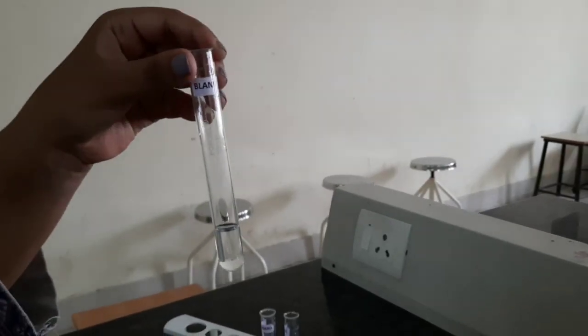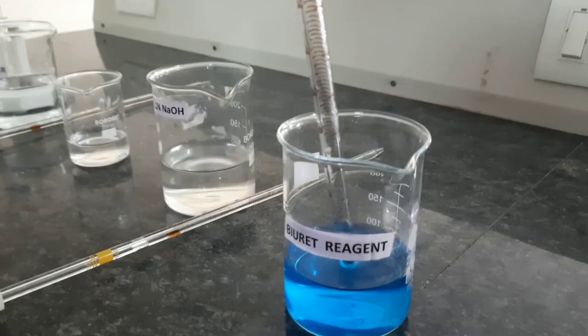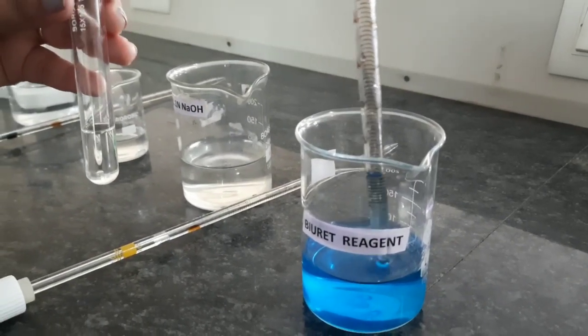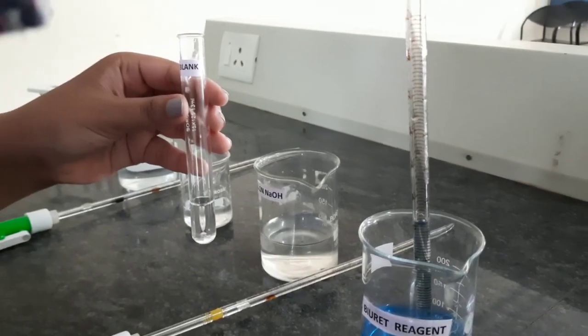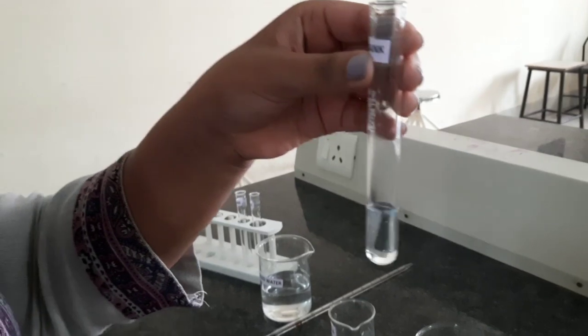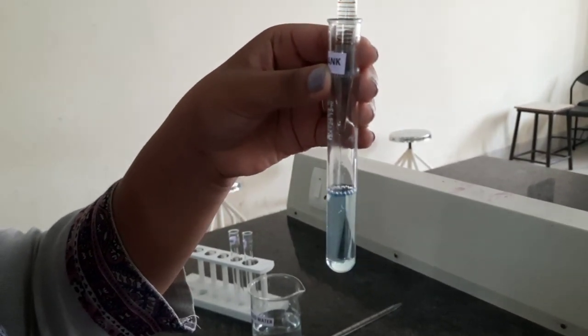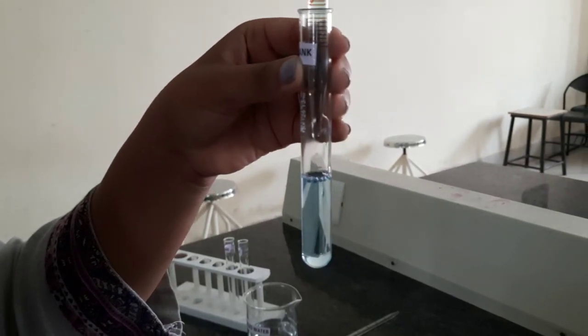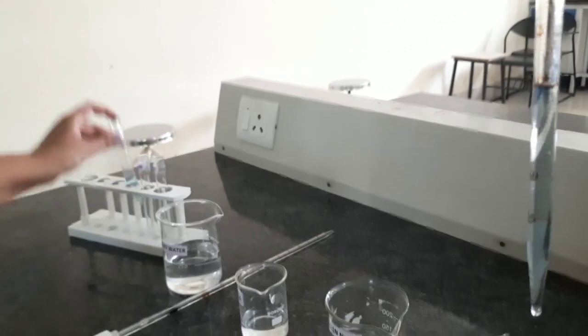Now to the blank tube we are going to add 3 ml of biuret reagent. You can see we are adding 3 ml of biuret reagent to the blank tube. Because of the biuret reagent, the color is blue.